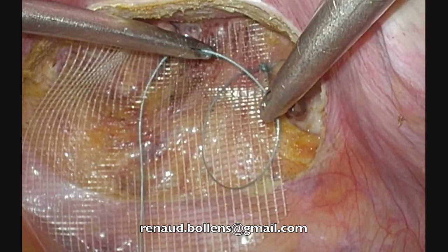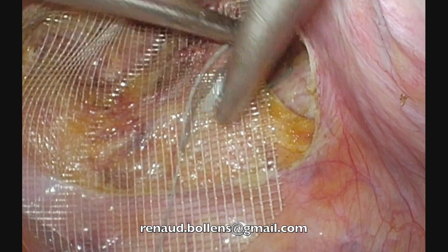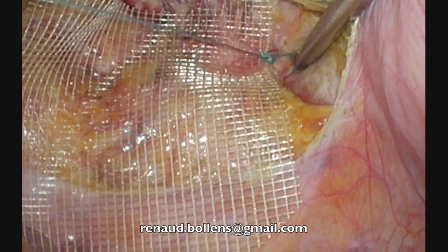Okay, the second one is the most difficult, because if I shake the first one, I will release the first one completely. Rotation of the left hand, traction, half loop, move my two hands together, I catch the short thread, I slide close to the fixed point, I jump over the needle drivers, and I tighten.